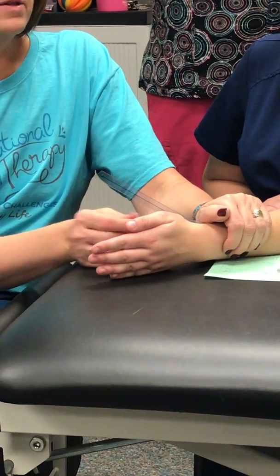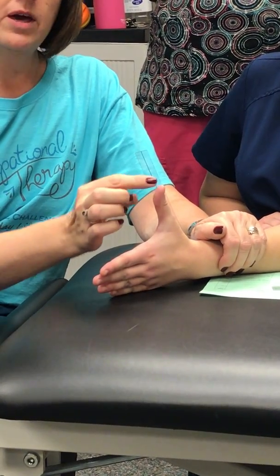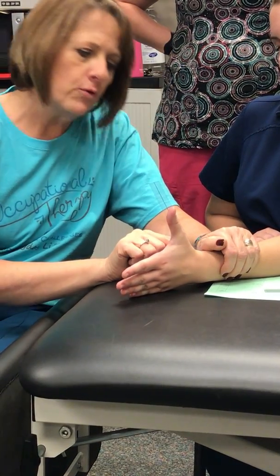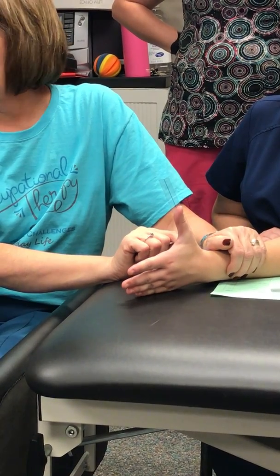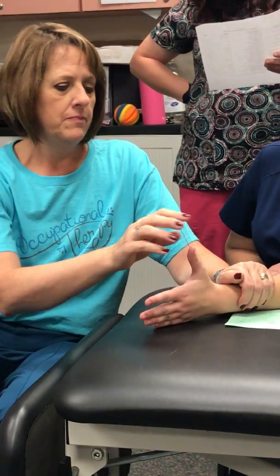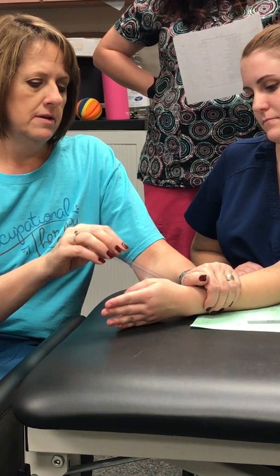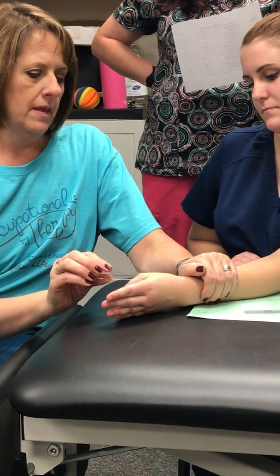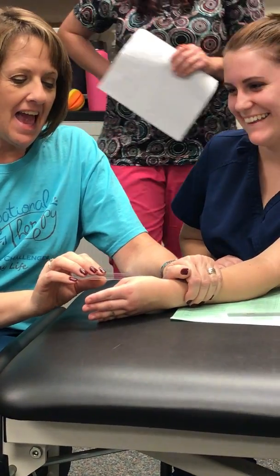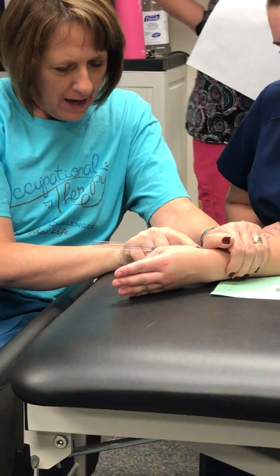I take my initial measurement and it's 15 degrees — that's my starting measurement. I'm going to have you extend. I'm only looking at the first phalange, and I got about 45 degrees. So I subtract 15 from that, because I started at 15 — that was my zero. She has 30 degrees of extension.